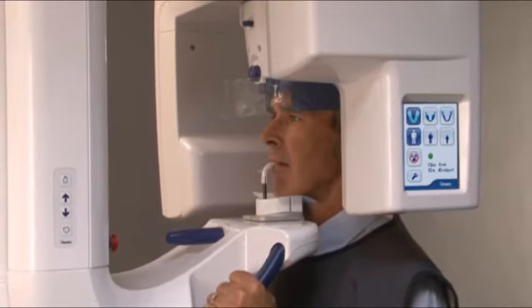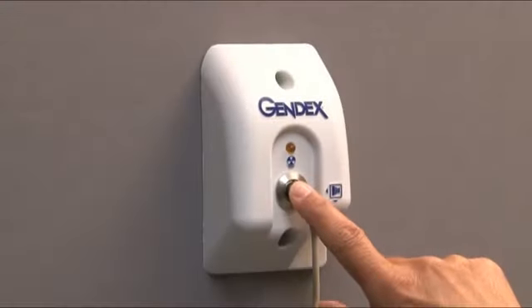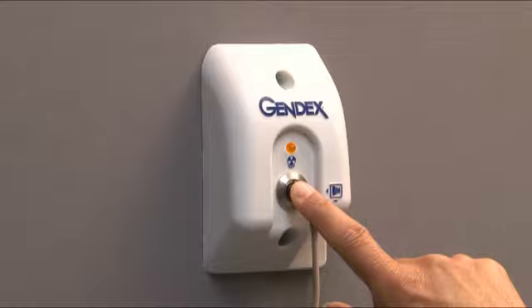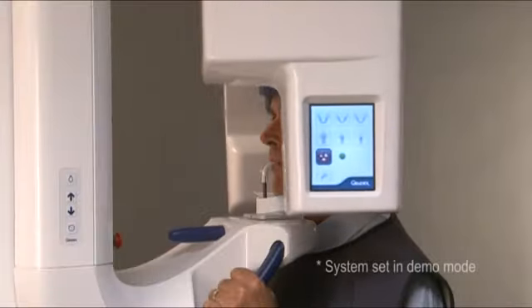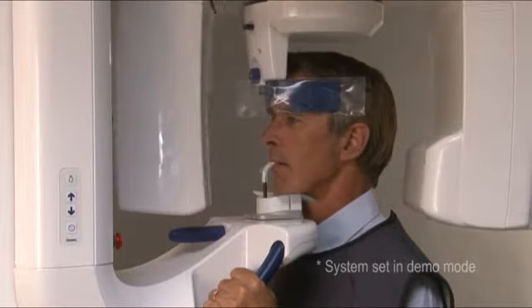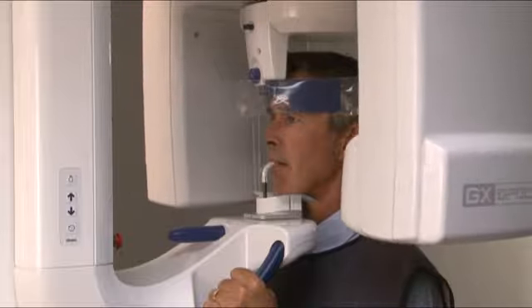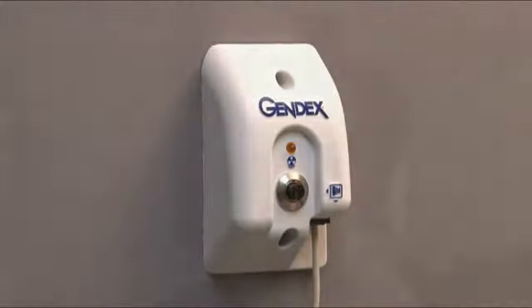Make sure that you can see and hear the patient during the exposure. Press and hold down the exposure button for the duration of the exposure. During the exposure, you will hear an audible signal and the exposure warning lights will come on. The rotating unit will move around the patient's head and then stop. When the rotating stops, the exposure has been taken.